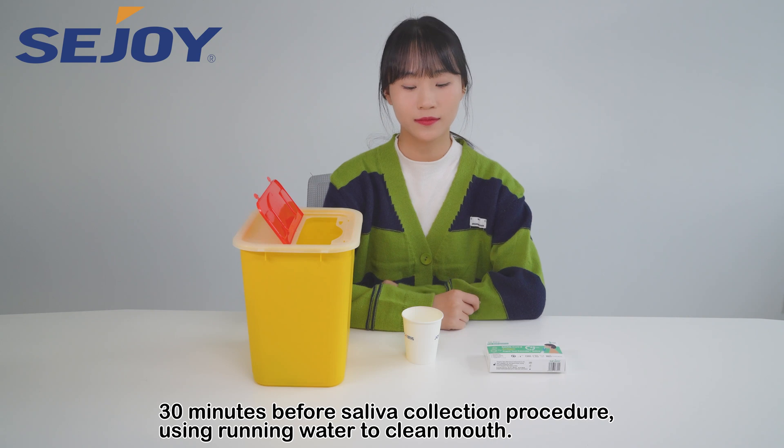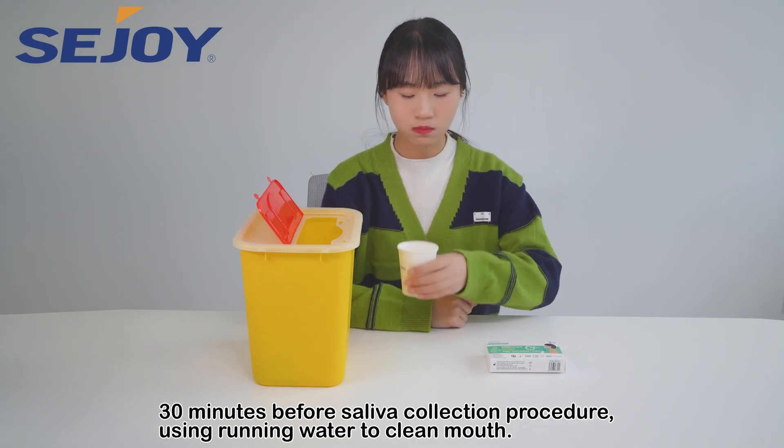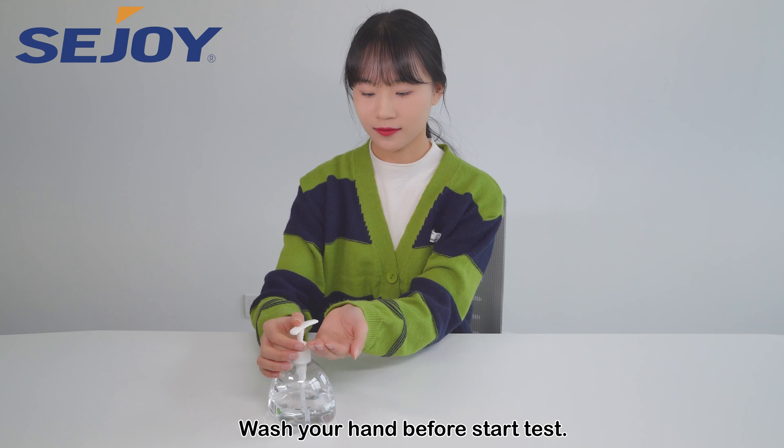30 minutes before the saliva collection procedure, use running water to clean your mouth. Wash your hands before starting the test.